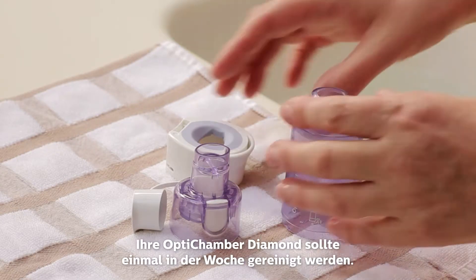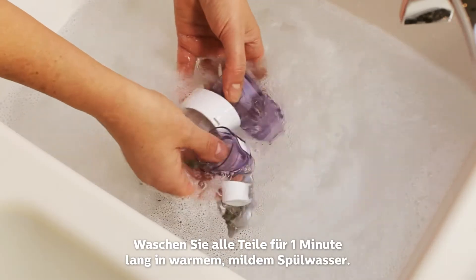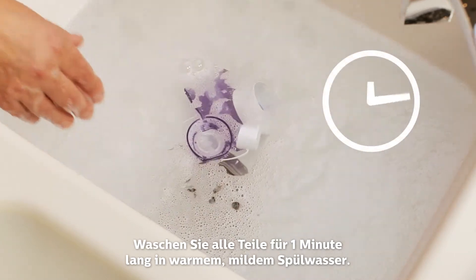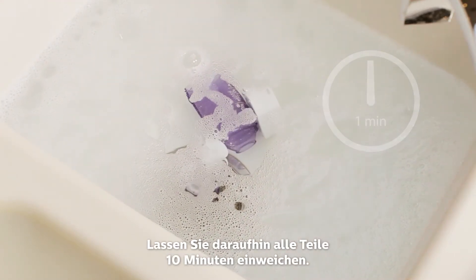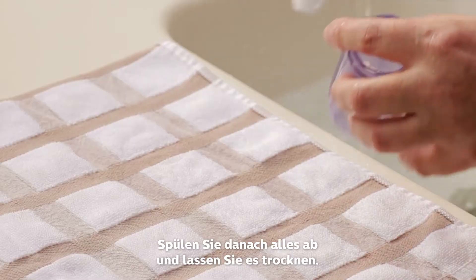Your Diamond should be cleaned once each week. Agitate all the parts in warm soapy water using a mild dishwashing liquid for one minute. Then soak for 10 minutes, rinse and shake out excess moisture, and let air dry.